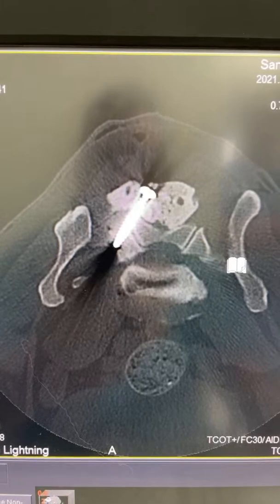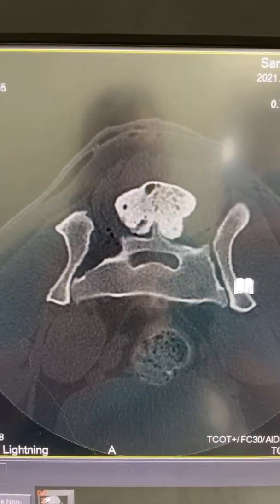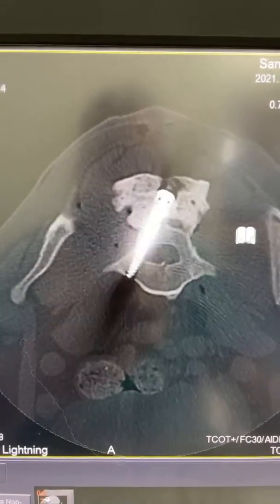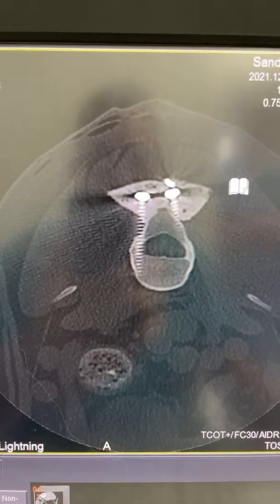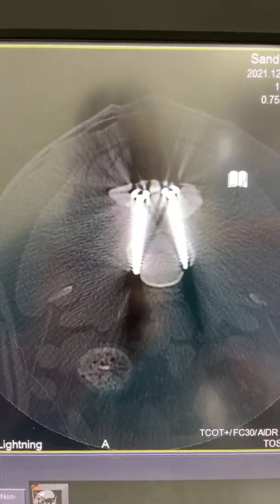Heading farther back, we've got a couple more screws here — one there and another one in the back. All of these screws are in really great position. The only one that might be a little concerning is the one that is just glancing off the side of the spinal canal.